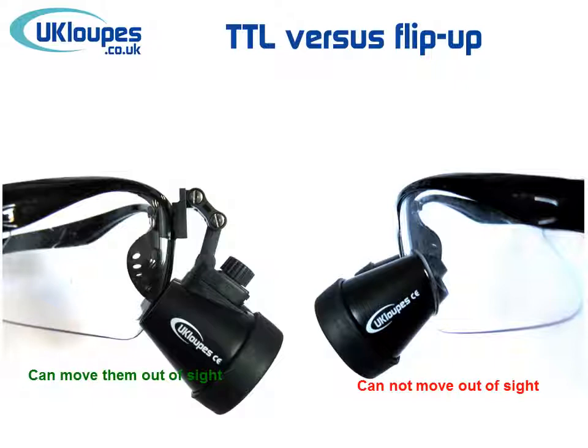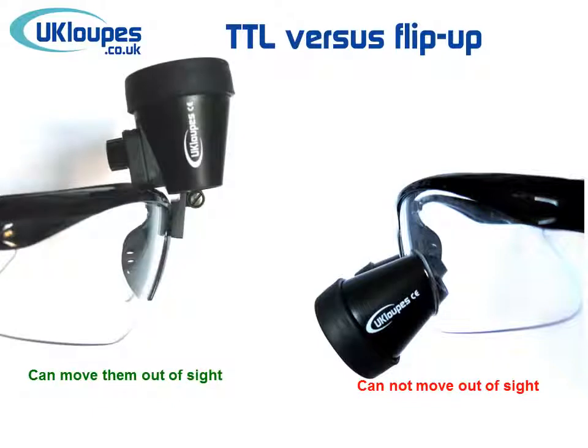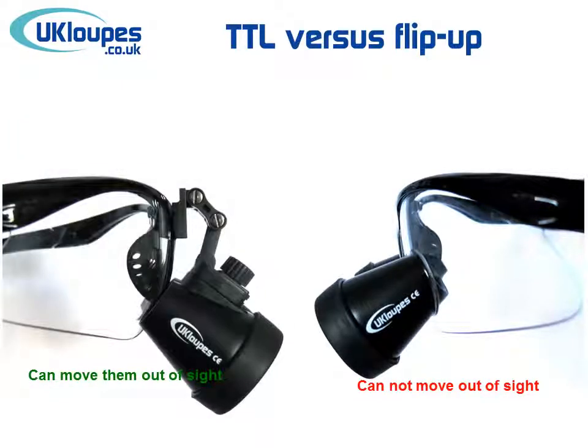Another benefit of having the hinge mechanism on loops is that when performing tasks that don't really need full magnification, they can be flipped up and out of the way, out of the line of sight. With the correct hinge tensions, they can rotate only about the uppermost hinge axis, so when flipped back down, they should be in the correct position, ready to use.